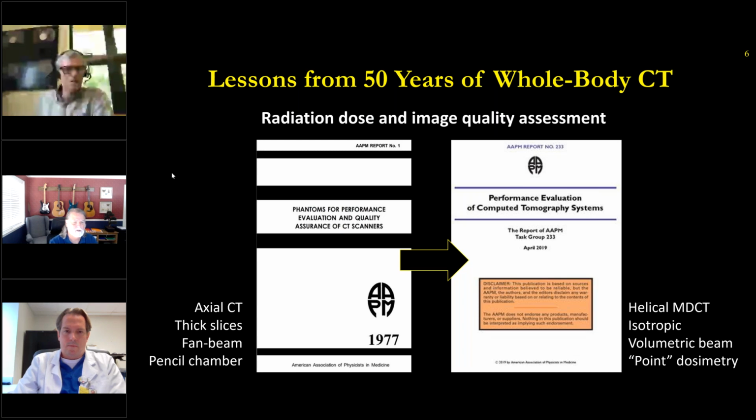They have really taken the lead in developing many of what are really just called task group reports, but many regulatory agencies, including the Center for Devices and Radiological Health, which is part of the FDA, have members who sit on many of these task groups and weigh in on the performance standards and testing methods that are written in these pages.